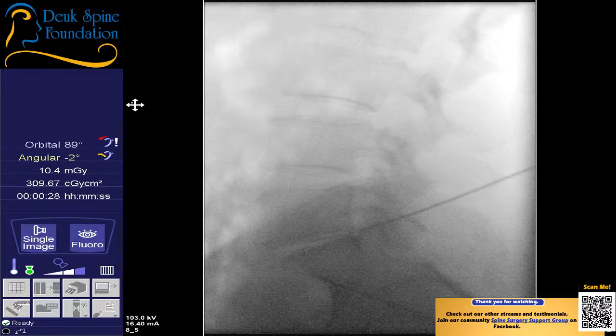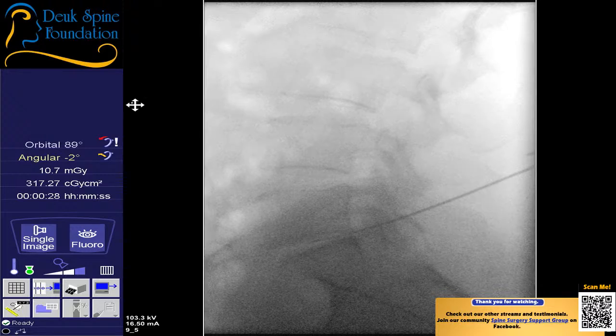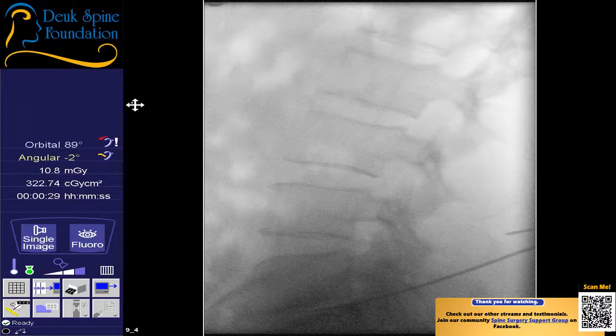Shot? So now we're going to get to the next disc. I think you can improve that a little bit with some WAG. You see how the pedicles are offset? Jordan, you see what I'm talking about? Give me some num-num. Nope, that's for the skin. Yeah, I think you need to move south a little bit. That's a perfect view down the disc, but you're too far north. Just a little bit south.